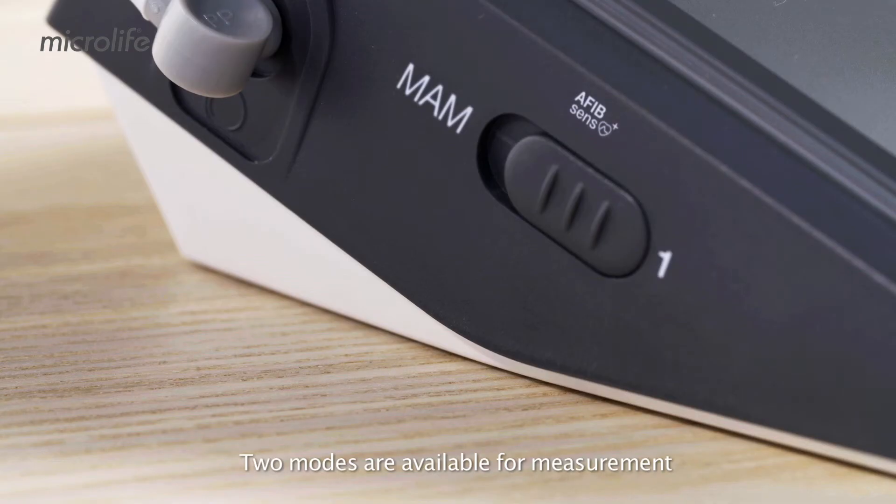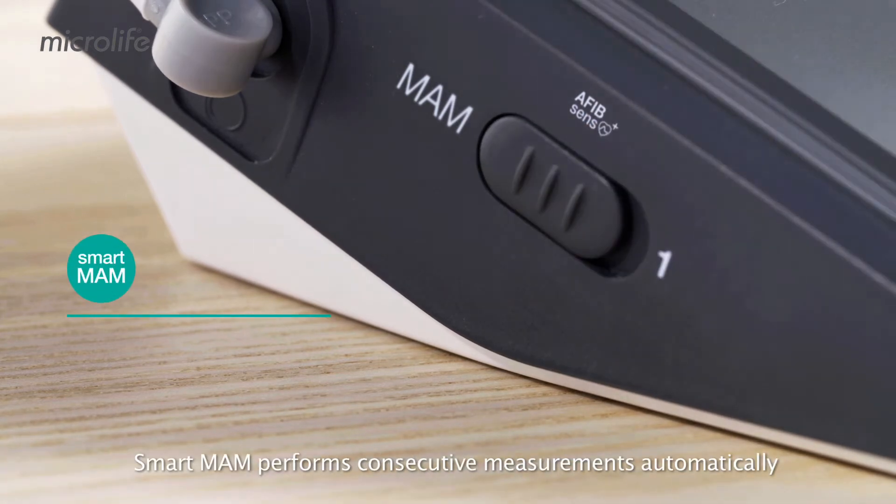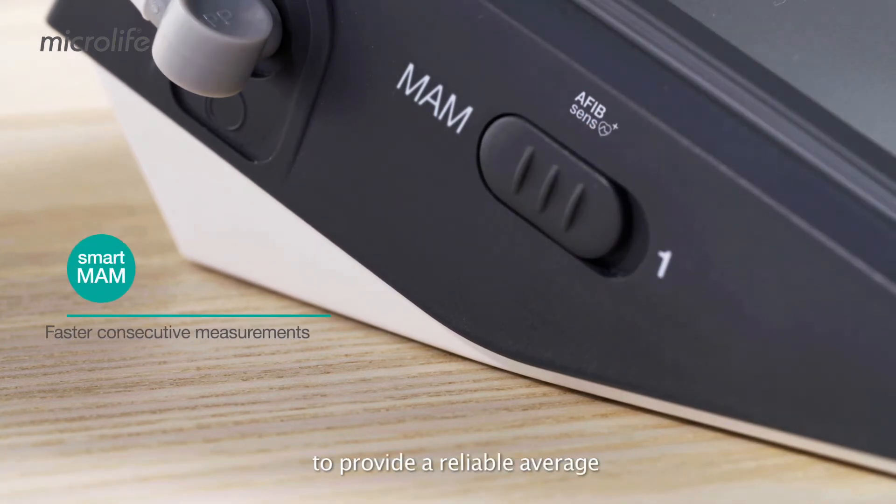Two modes are available for measurement: Standard and Smart MAM. Smart MAM performs consecutive measurements automatically to provide a reliable average.